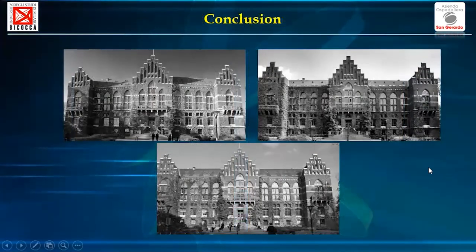And so to better describe the application of spectral CT in everyday clinical practice, theoretically, I make you another question. We are in front of University of Leuven, but I think that nobody is able to distinguish the season, which is the correct one. We can recognize the building with window, with the green and herbs and so on, but nobody can offer or make us the correct season decision. Now we can add our spectral approach, our colorimetric approach, and I think that everybody becomes again more confident with the season. So recognizing the spring, the summer, and the autumn at once.